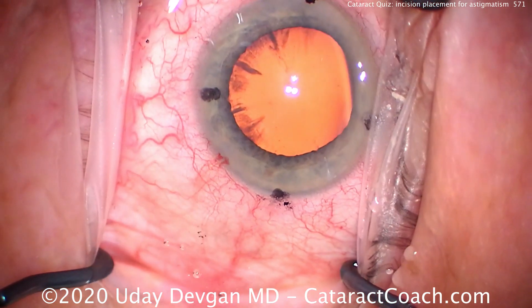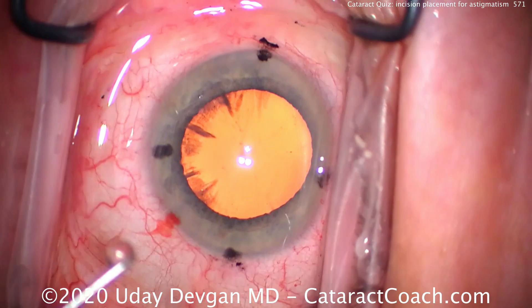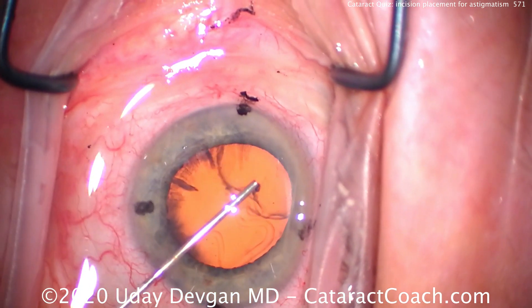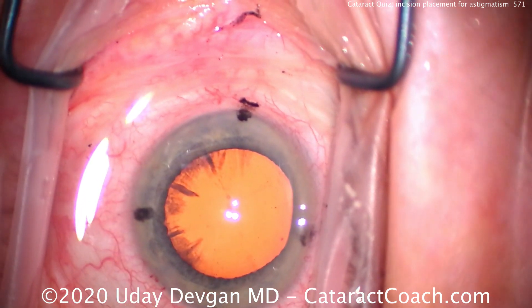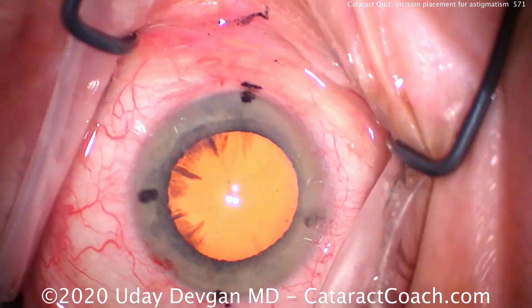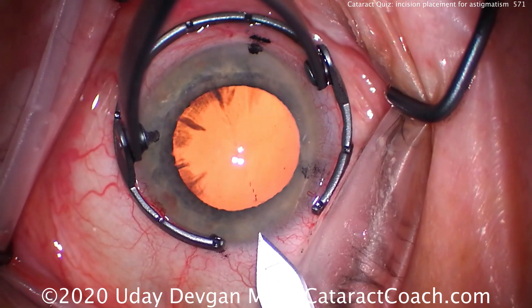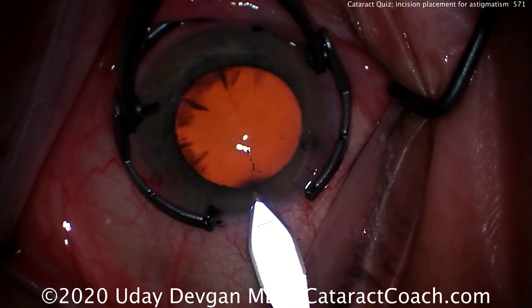The phaco incision will induce astigmatism, and that's important to know. If we make the phaco incision on the steep meridian, it will help reduce the total astigmatism and not shift the axis. So that's what we're going to do here — we'll line that up and make this incision right at that steep meridian.